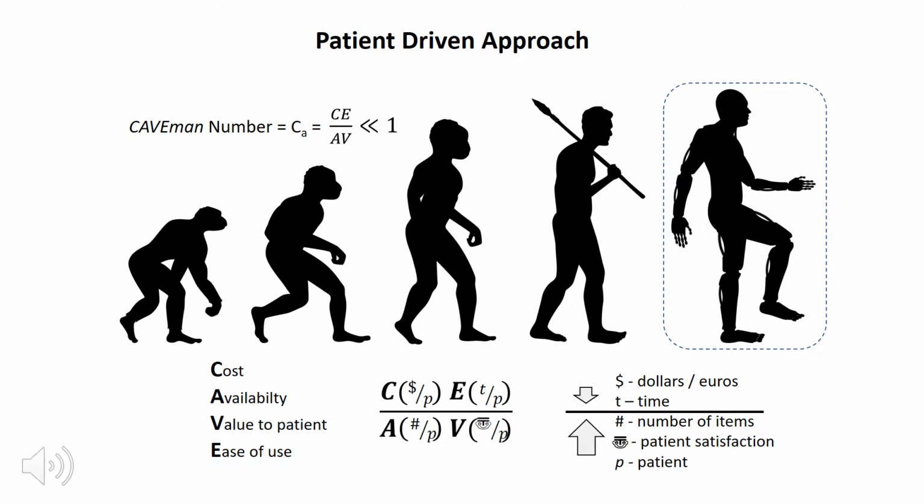And this will eventually be the conclusion to my slide. Some combination of stimulation and exoskeleton that puts all the technologies together to create the desired outcome, which is walking and regaining our mobility.